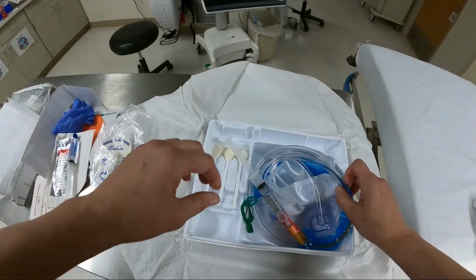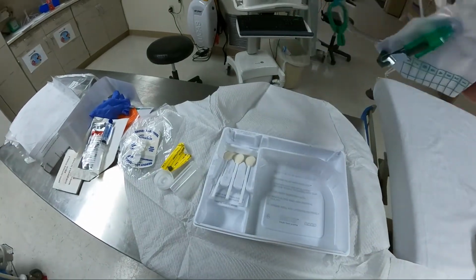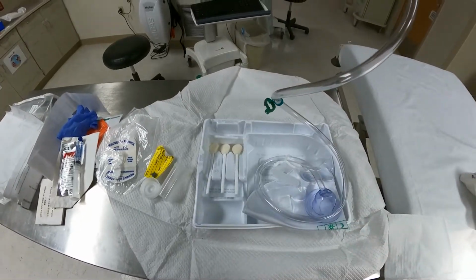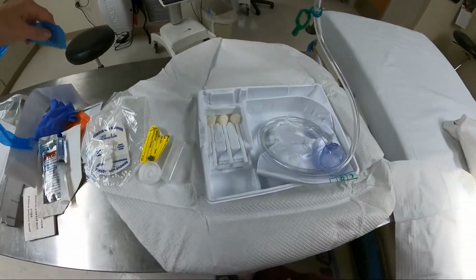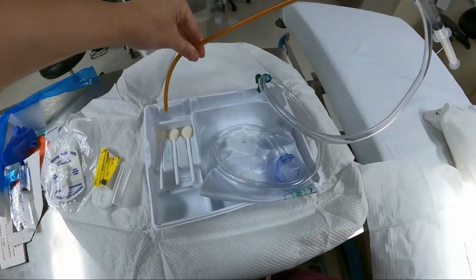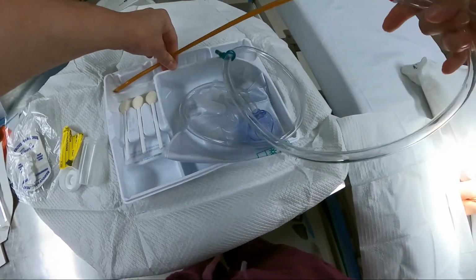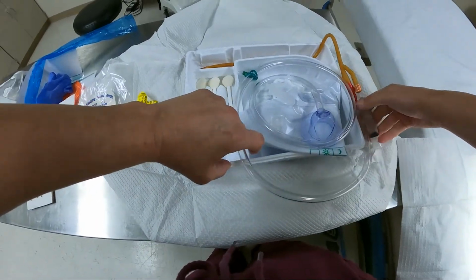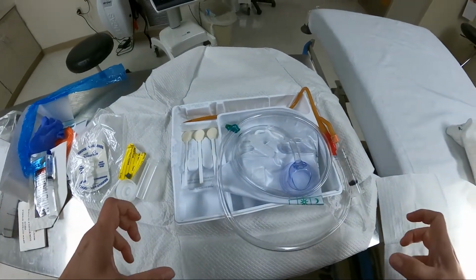And then, when you have your catheter here, remember, you're still sterile, so you make sure everything's going to work. Take off your sheath, maintaining sterility, because you don't want this catheter to flop around and hit something. So we have that off. There's your catheter. Now, it is designed so that while you're finishing up, it will lay just like that. See? It holds it there so long as you're not dangling off of something.